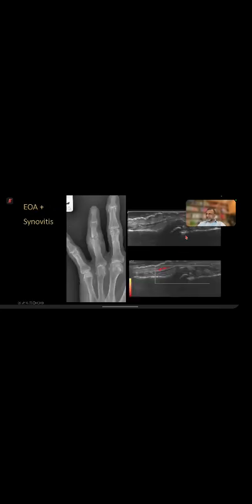And we did the injection in this patient. You can see those osteophytes there. This is all synovium, all thickened synovium. Although it's not acute synovitis, because there is no neovascularity, this is chronic synovial thickening in erosive osteoarthritis. Erosive and proliferative, no, this is not proliferative arthritis. This is entirely different. Okay. Because if you say proliferation, we are talking about different things.